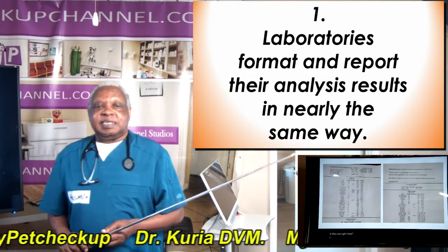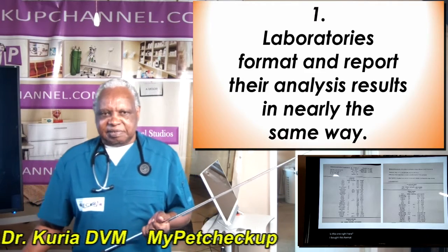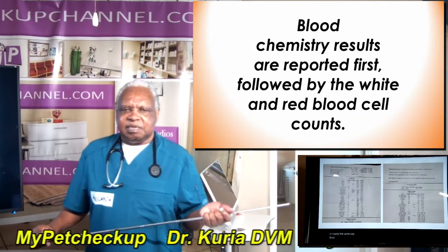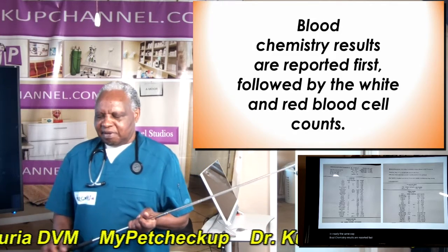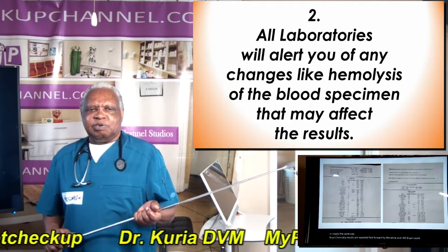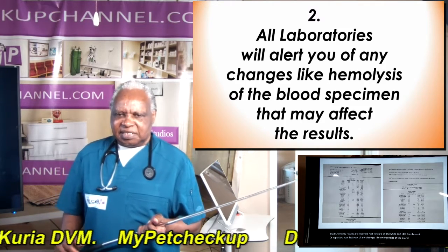Laboratories format and report their analysis results in nearly the same way. Blood chemistry results are reported first, followed by the white and red blood cell count. All laboratories will alert you of any changes like hemolysis of the blood specimen that may affect the results.